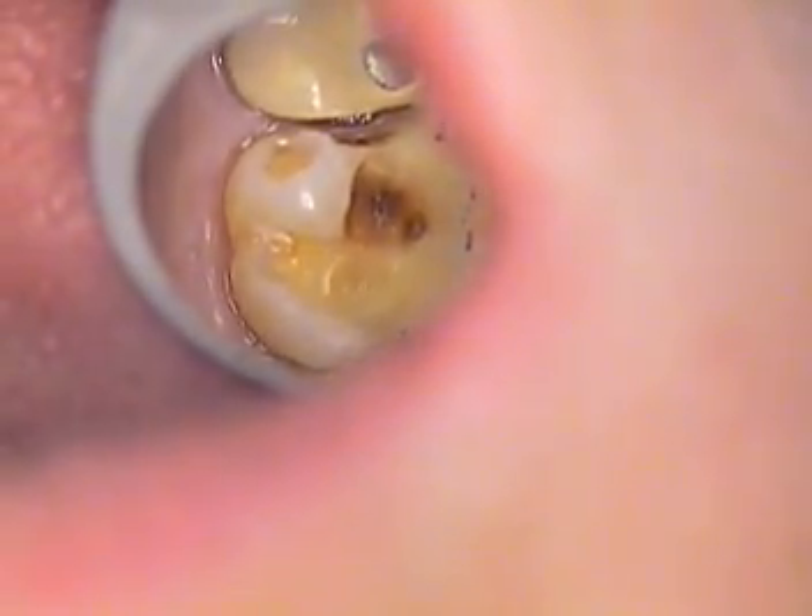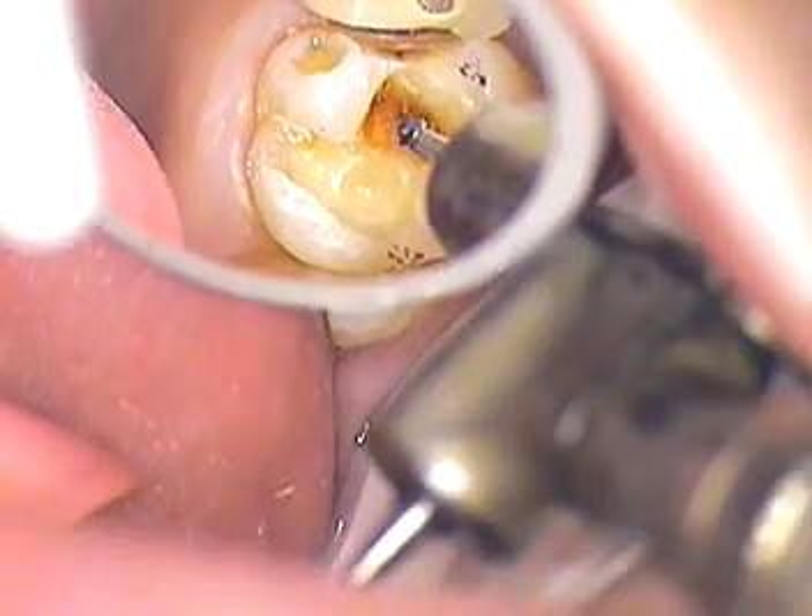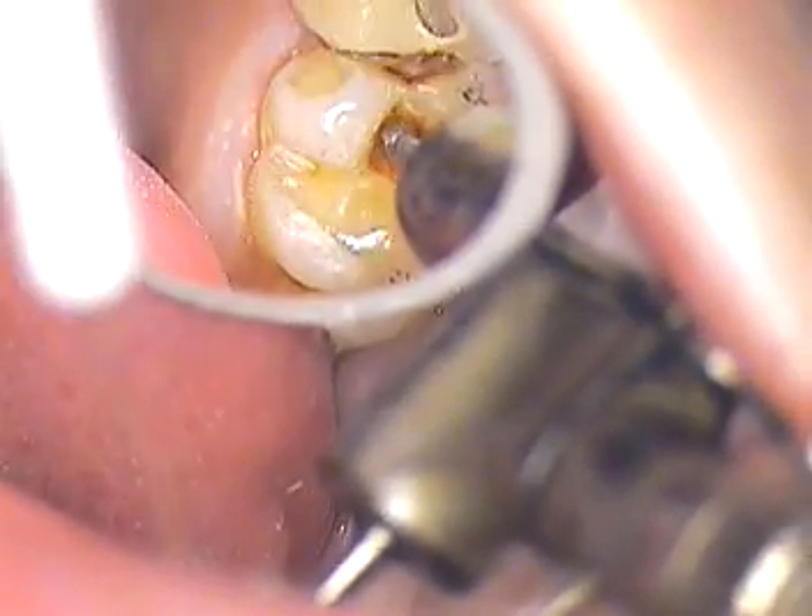All right, so we're going to get back to work here. I'm going to use a round burr. We've outlined this particular prep, and we're trying to stay as conservative as we can. I'm going to introduce just a little vibration now in water.